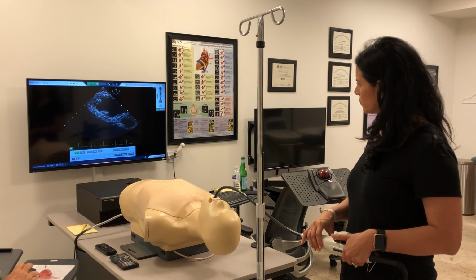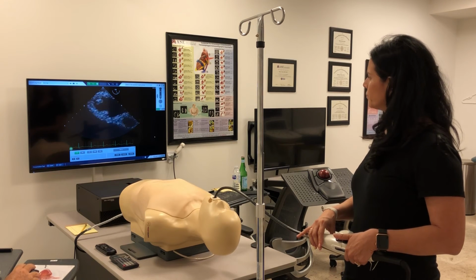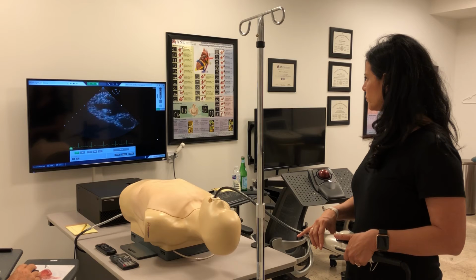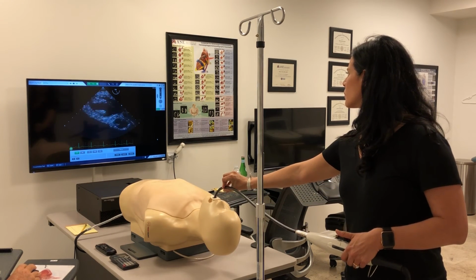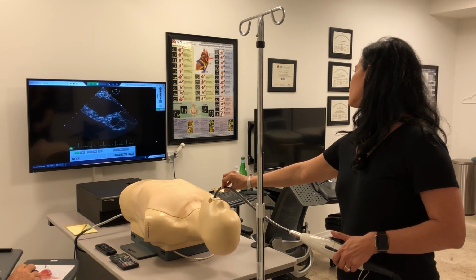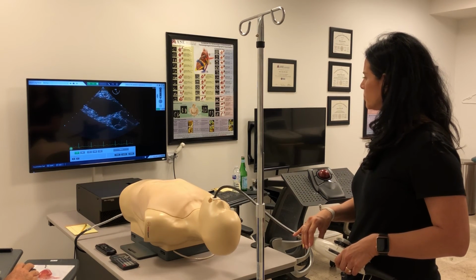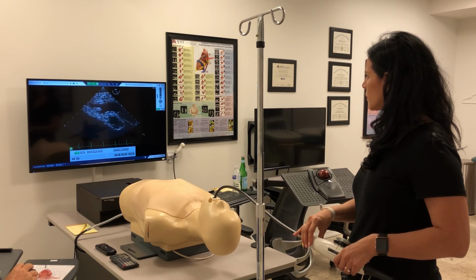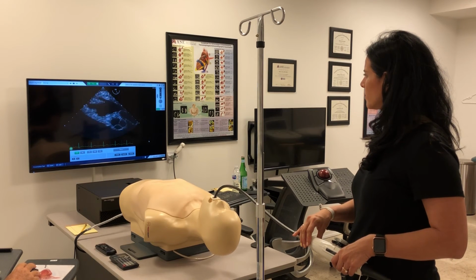And then we can kind of appreciate that you do have a nice aortic valve, but it's mostly off the screen. So in order to get it on the screen, at this point, I would pull the probe out a little bit and turn right. And all you want to do is bring it just on screen, because that is actually the perfect Doppler angle. The closer this is to the right edge of the screen, the better the Doppler angle. If you were to manipulate this image to bring it to center screen, that would be a less favorable Doppler angle. Good.